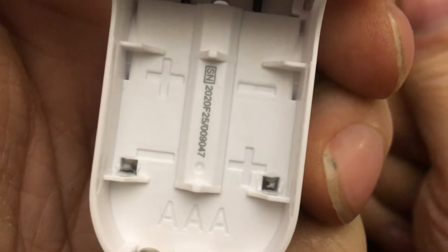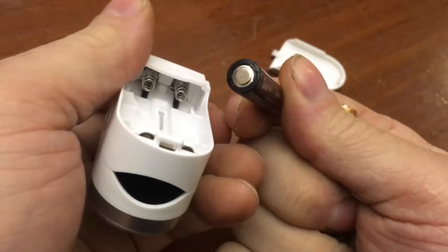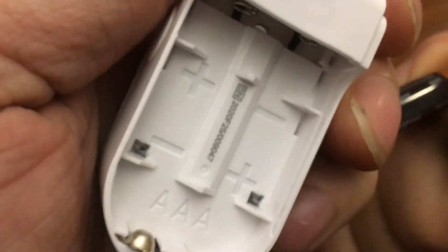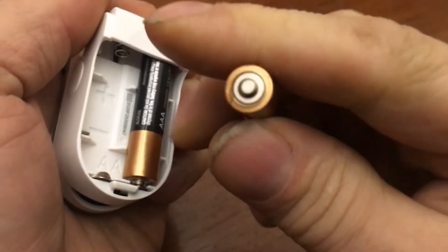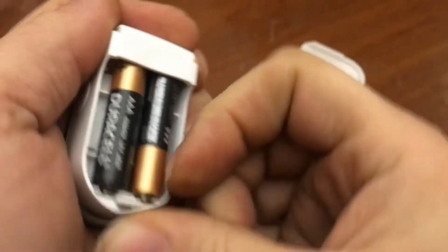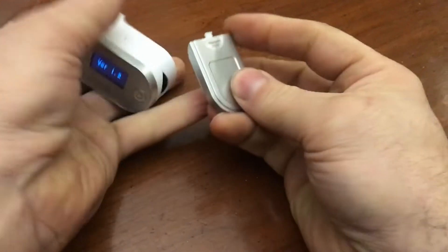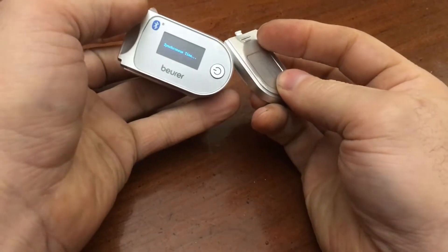Negative, positive, positive, negative. The springs — when you see a spring you usually assume that's the negative, but this one is saying no, this one is negative and that one is positive, which is very odd. As long as it connects once you click it in.